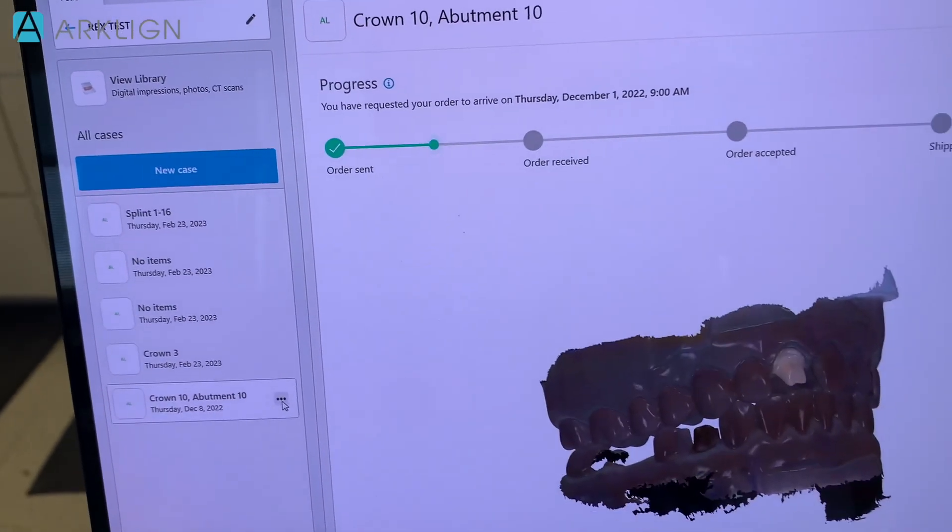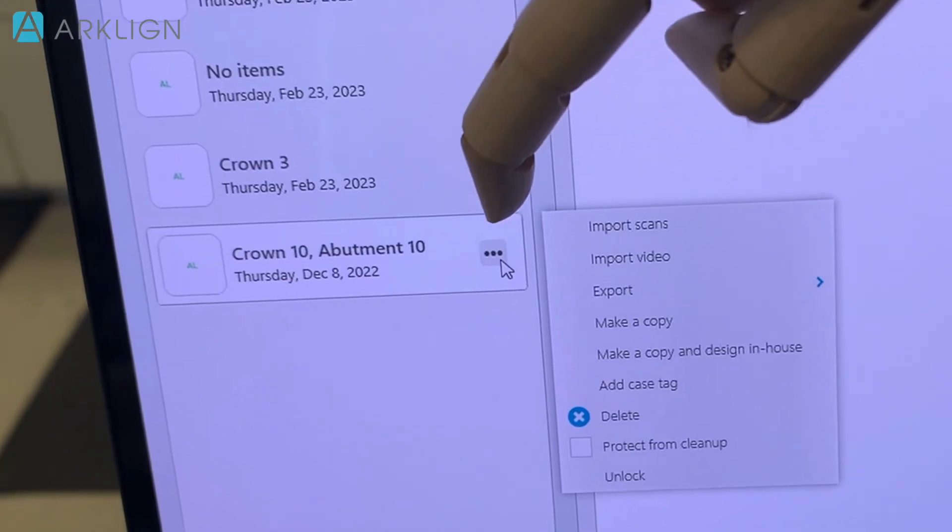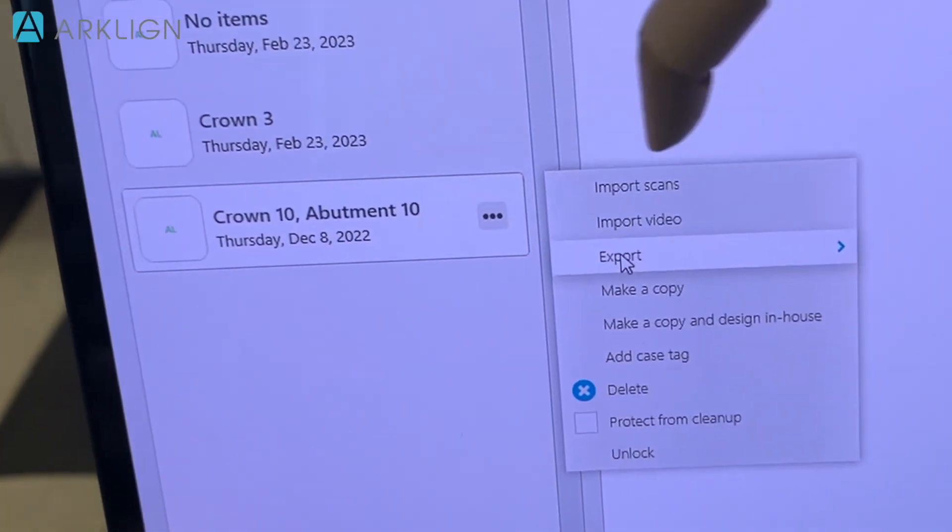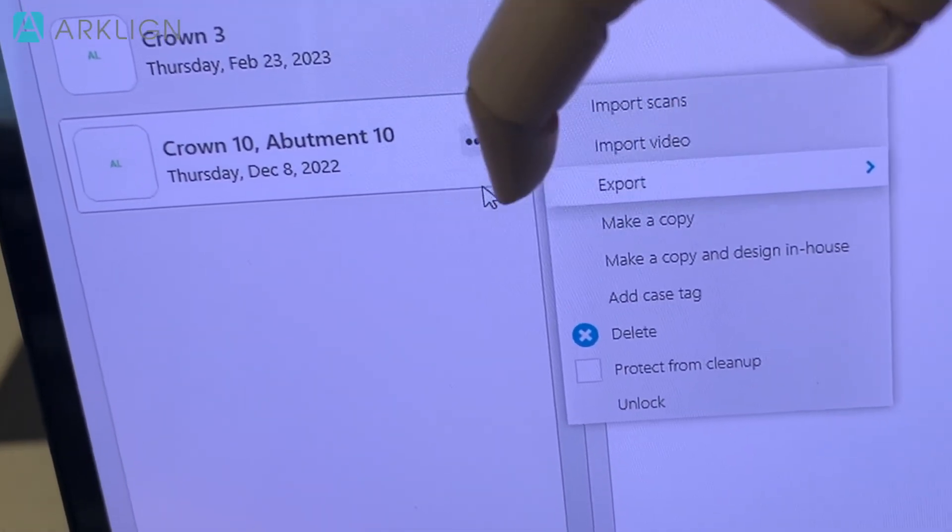Click into the three dots. Export. Scan.